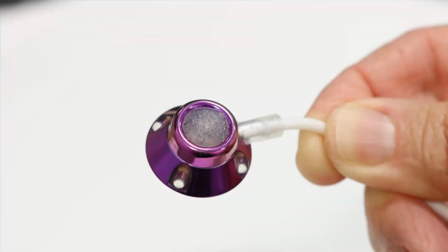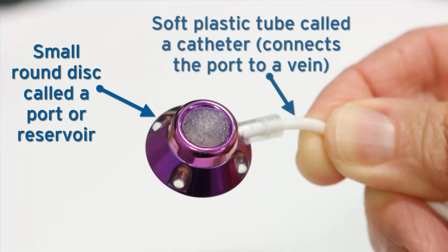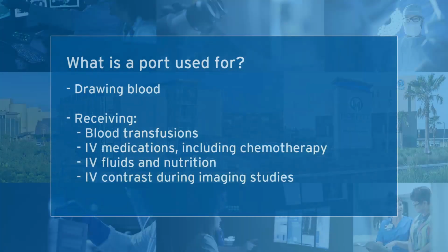The device has two parts: a small round disc called a port or reservoir, and a soft plastic tube called a catheter, which connects the port to a vein. A port can be used for drawing blood, receiving blood transfusions, receiving IV medications including chemotherapy, receiving IV fluids and nutrition, or receiving IV contrast during imaging studies.